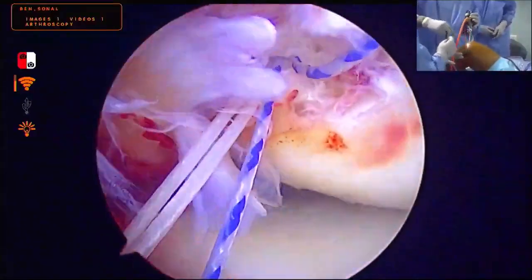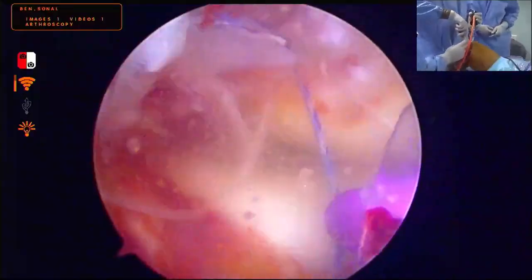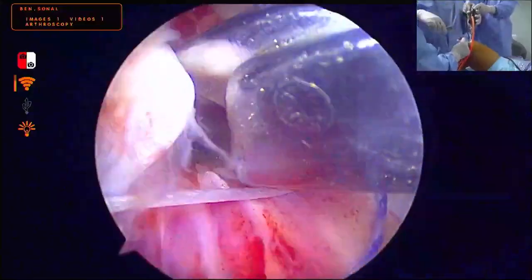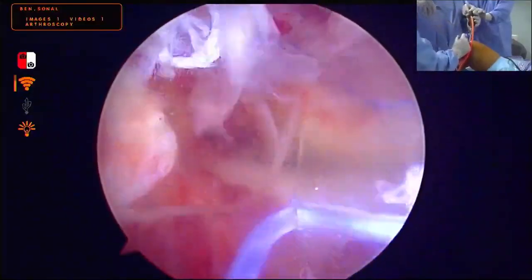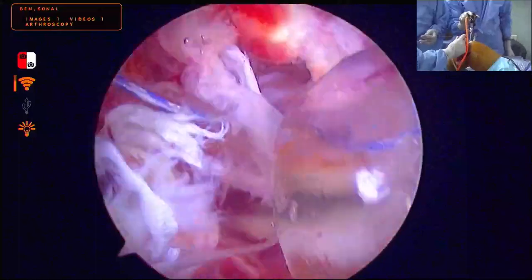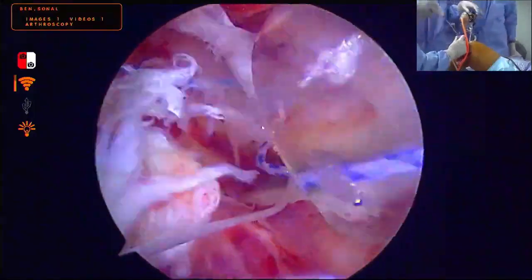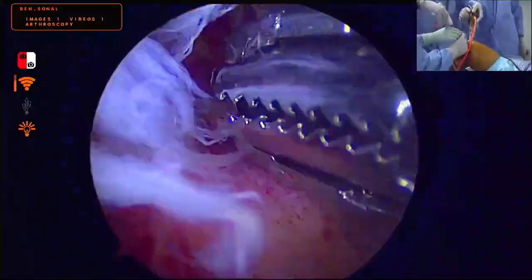Tocar please. Cannula please. Green cannula please. Hold it please. Okay, hold it please. So now we are using a first pass mini anchor device to pass the anchors. Cannula needs to be pulled back.